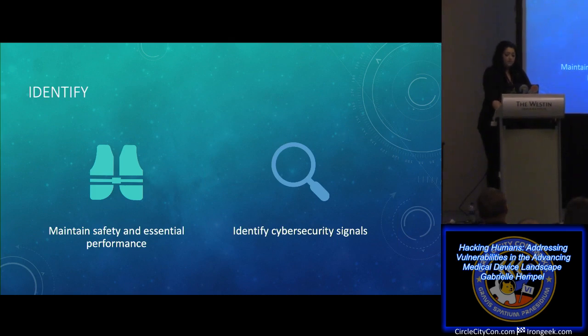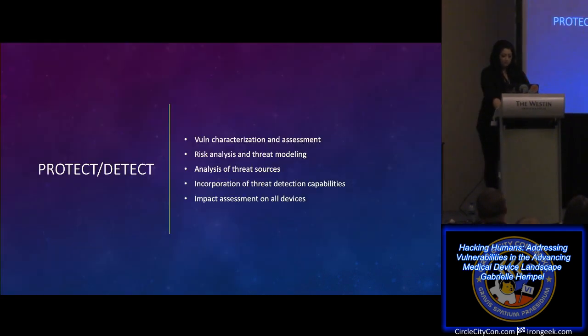Maintaining safety and essential performance of devices, identifying cybersecurity signals that might affect the product, characterizing and assessing vulnerabilities, performing risk analysis and threat modeling, analyzing threat sources in order to provide a framework for risk introduced by an active adversary, incorporating threat detection capabilities, and performing impact assessment on all devices.